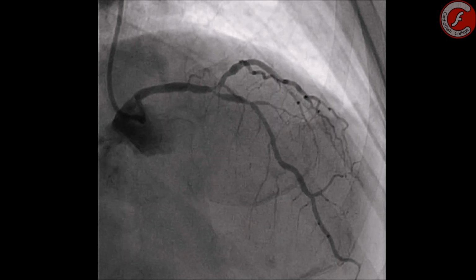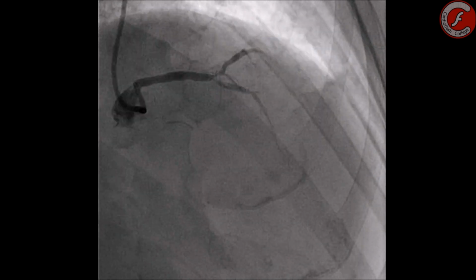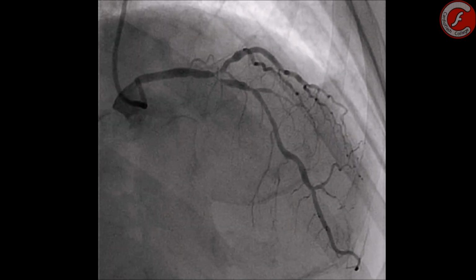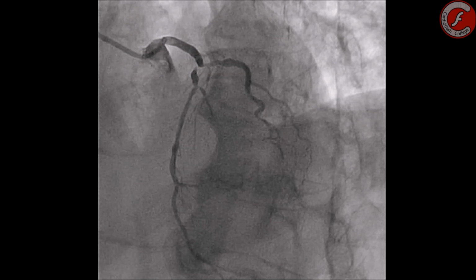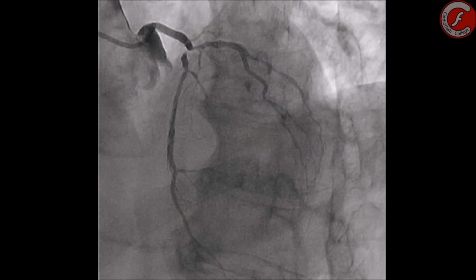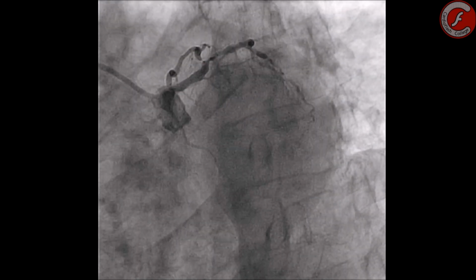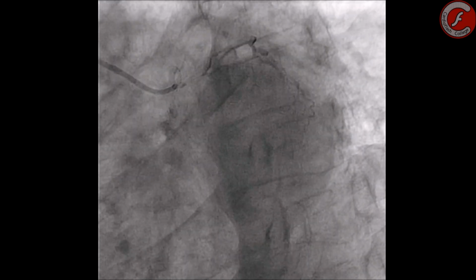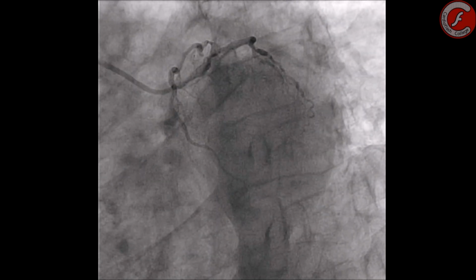As you already know, the percutaneous treatment of coronary bifurcation lesions can be an absolute challenge for the interventional cardiologist, because different clinical and angiographic factors need to be considered during the planification of the procedure. Different therapeutic options exist in the world of coronary interventionism and coronary bifurcations, but today we are going to show you a, nowadays, very popular angioplastic technique with two stents. Today, we will teach you how to make your own culotte.